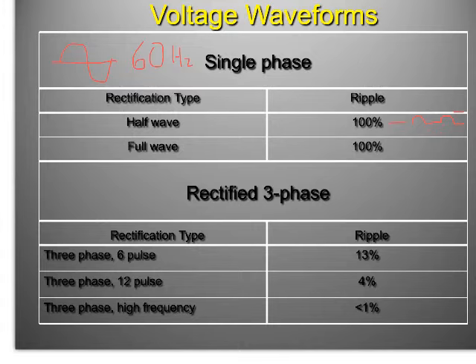Because I don't want to make an image that way. A certain percentage of the photons that I'm making would just be irradiating the patient and have no promise of making an image, because that's 100% ripple.